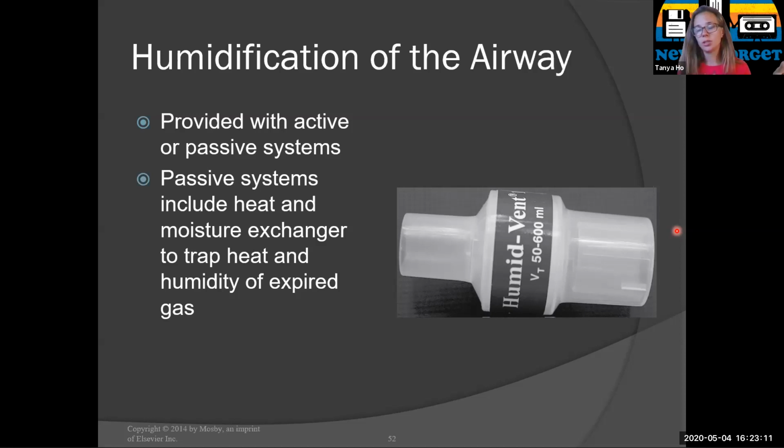It's just like with a tracheostomy when you're changing the ties, you cannot let go of the trach. When that tube is not secured, that is their airway. They've been sedated and paralyzed for this process. If something happens to that airway, they could die. If you let go, that's an automatic fail on the competency.